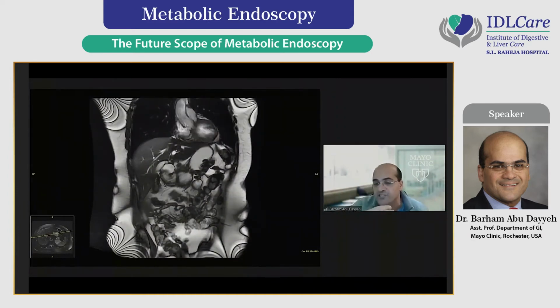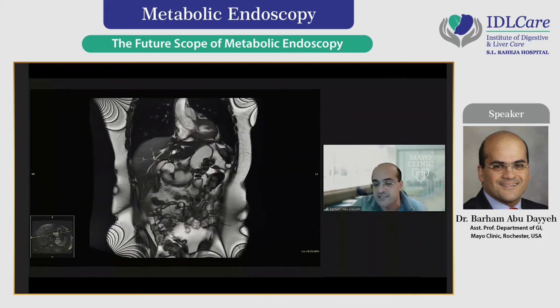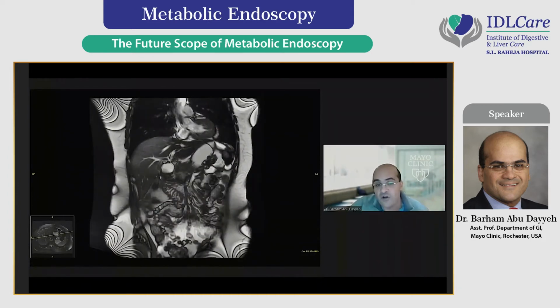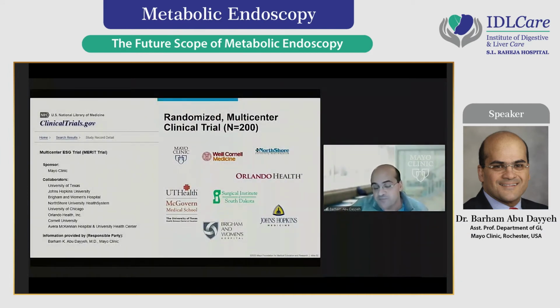The safety is excellent, and the tolerability of the procedure is excellent. So it's a procedure that highly appeals for patients, and thus far it's gaining significant momentum. So again, the theme of randomized trials continues with endoscopic sleeve gastroplasty. More than 20,000 cases performed, more than 2,000 of these published in the literature.